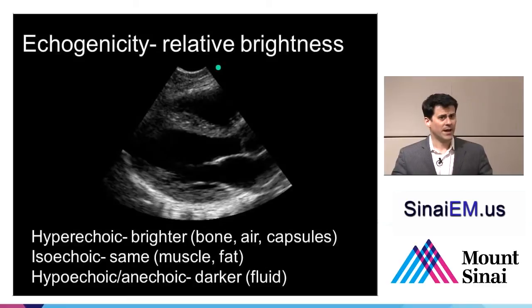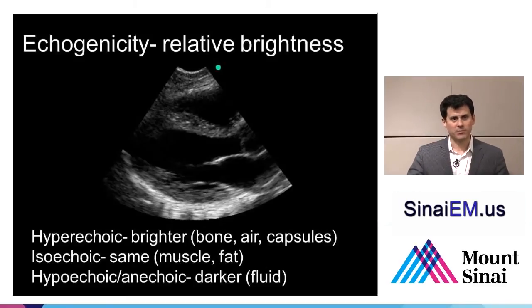So when we talk about something being hyperechoic, that means it's really bright and it sends out a lot of signal returning back to the ultrasound transducer. Remember, I told you the transducer itself is, at the risk of oversimplification, a water-dense structure, and the gel that's used as a coupling medium between the transducer and the person is also a water-dense medium. And skin, soft tissue is again roughly water-dense. So that simplifies things a bit when we think about density changes from that point on.